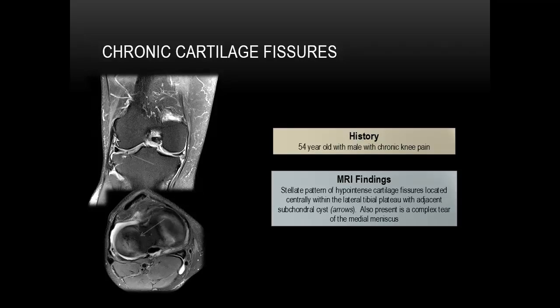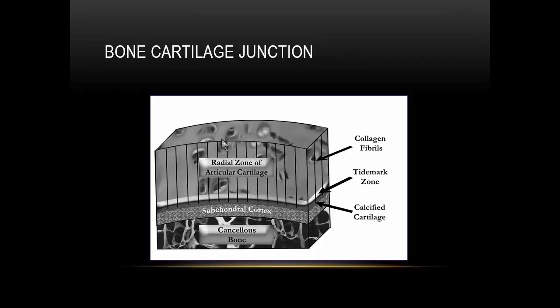This is something that's been around for months to years. So we want to be able to look at identifying these lesions and trying to extract from that, playing a little more of the forensic pathologist, what's the underlying driver of those symptoms within this particular patient? What is the chronicity? What are the types of mechanisms of injury that would drive these types of cartilage lesions? And does it make sense in the clinical context of this particular patient's presentation?